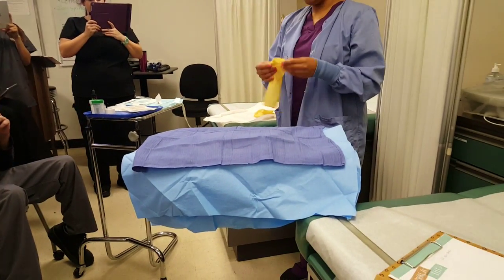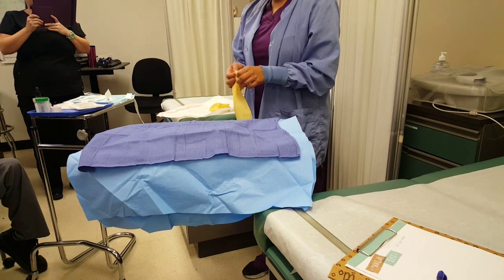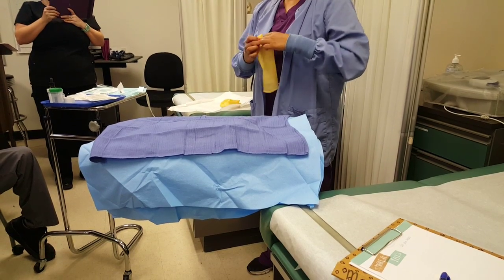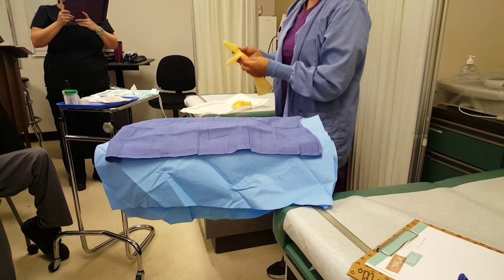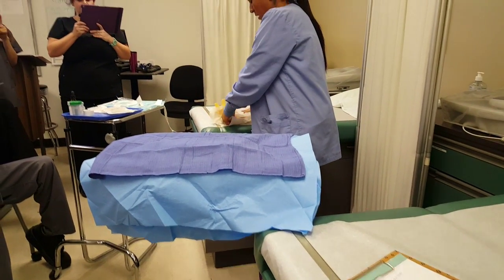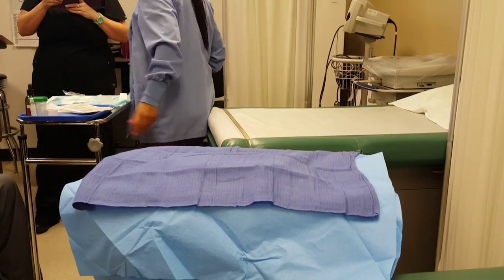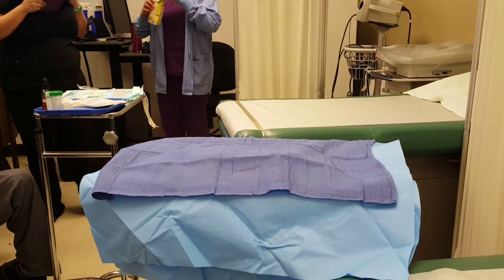You use one pair of gloves to set up your items and then a fresh pair of gloves to assist the physician. When you are ready to do the procedure, you are the last person to put on your gloves, because you're still going to be assisting — for example, putting on your doctor's gloves. I'll have Miss Newman be my assistant today.